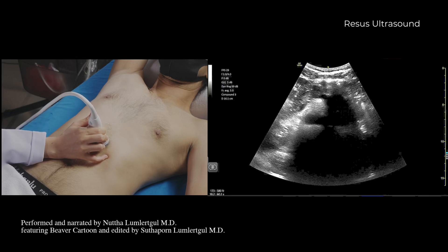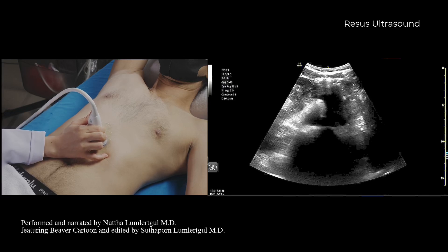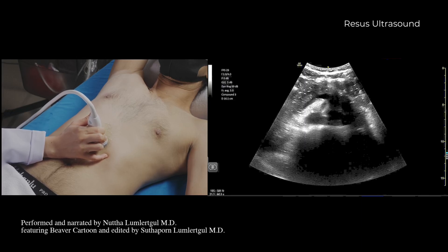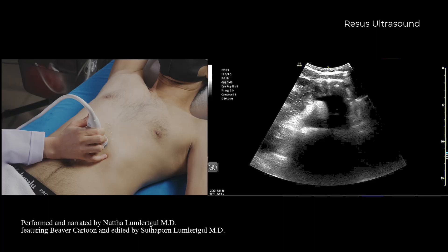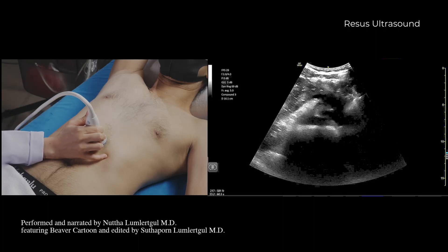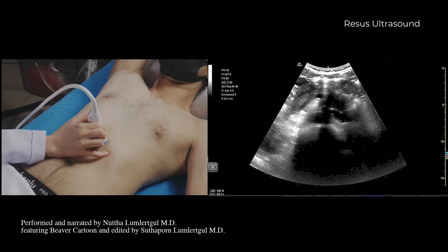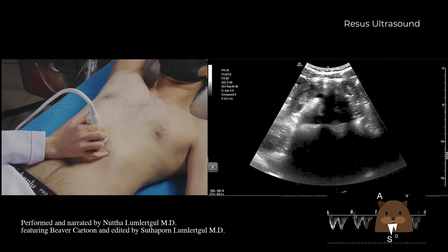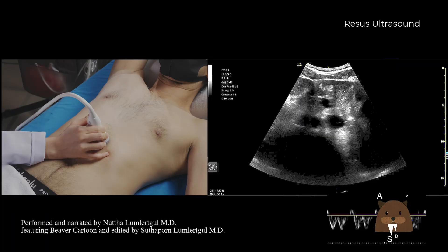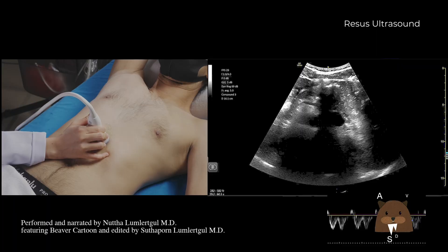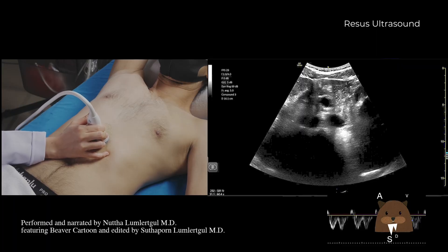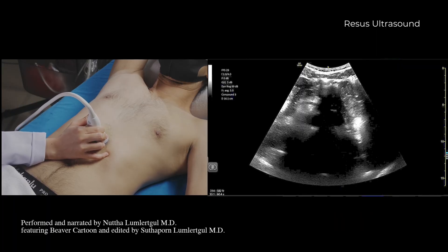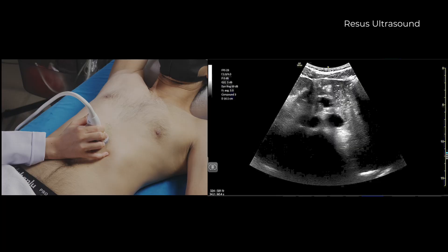In this video, I'm going to demonstrate how to perform the venous excess ultrasound, or VEXUS, which is a focused technique used to quantify venous congestion. It begins with measuring the maximal diameter of the IVC, based on the assumption that the IVC dilates with elevated right atrial pressure.